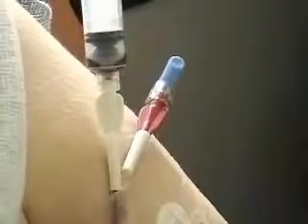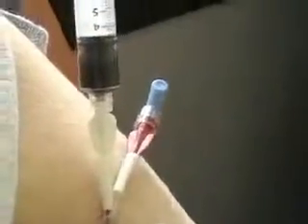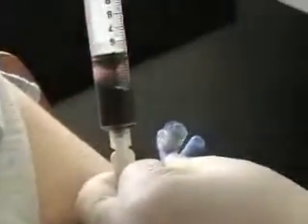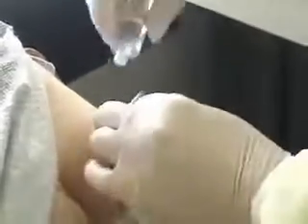She said we only need about three or four cc's for the sample, so hopefully we can get that this time. The lab already sent you the tube? Correct, yes — I have the tube from the lab and I've labeled it. That's very important: students, always label your tubes going to hematology. Did you get your blood? I did. Wonderful!